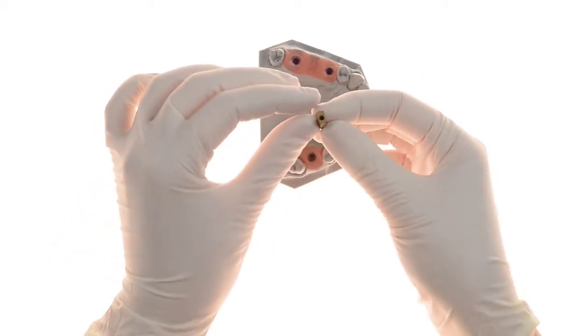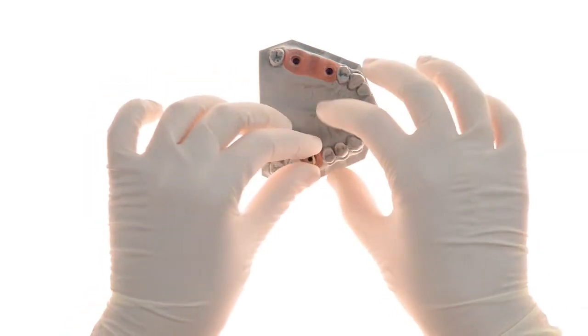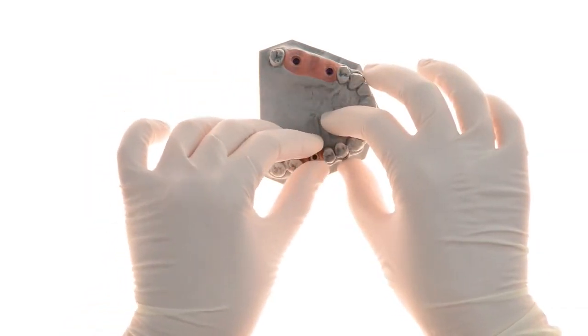This is the unique MIS scan post used with the EasyBase. It is placed with its narrower side facing the direction of the angulated screw channel.